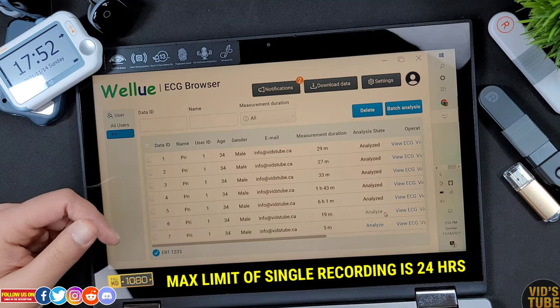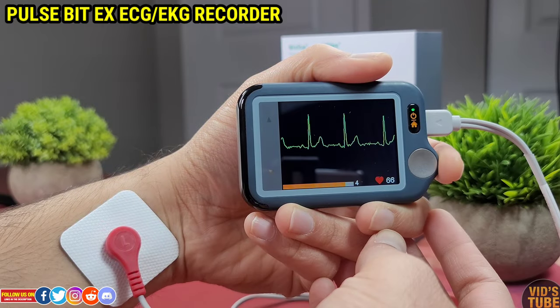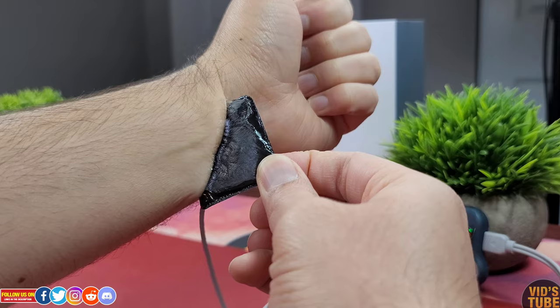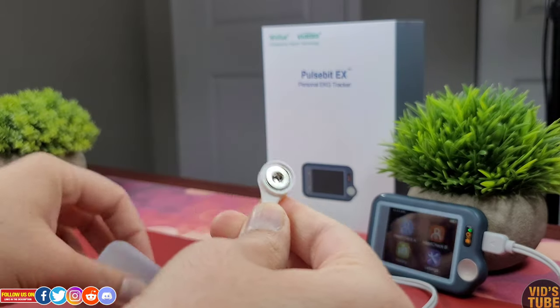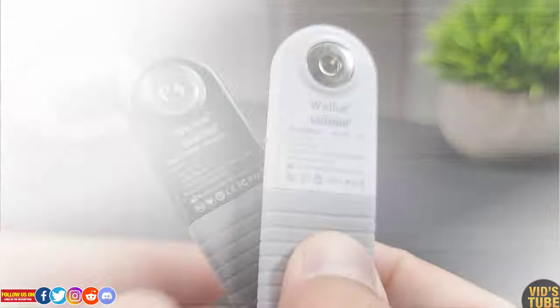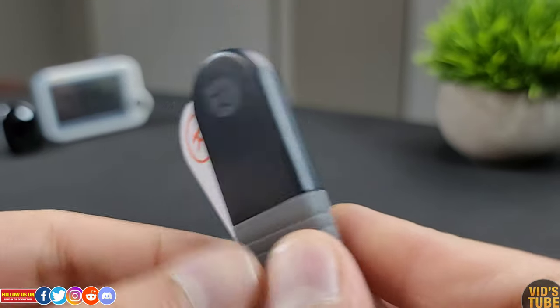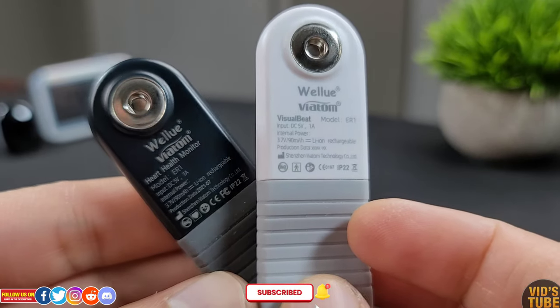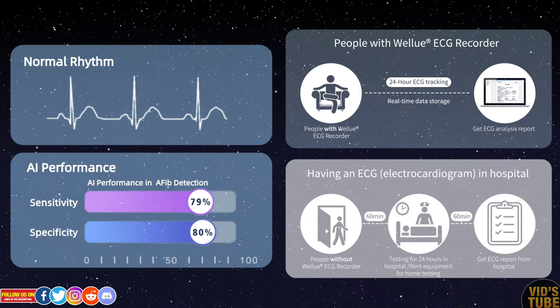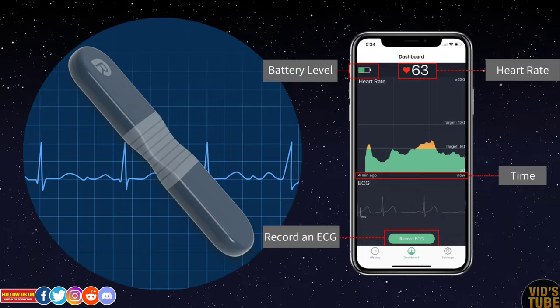A single recording cannot exceed 24 hours, which is quite remarkable as you can record a whole day's worth of ECG data. I recently reviewed their Pulsebit EX ECG recorder which costs $119 US dollars, but you can't record 24-hour data and there is no AI to interpret the data. Another difference compared to the strap-free heart rate monitor at $69 US dollars is that it does not have AI ECG analysis, which can screen up to 14 different kinds of abnormal ECG events — hence the price of this AI ECG recorder is justified.